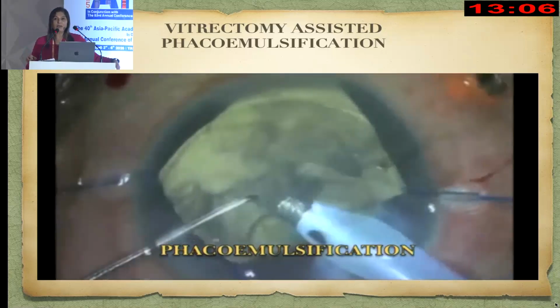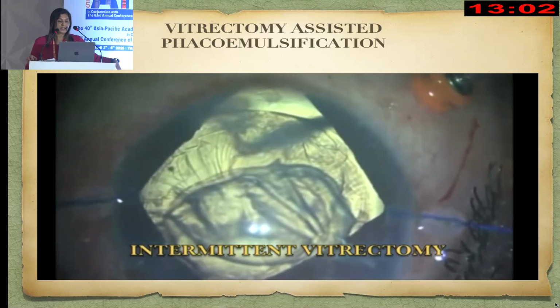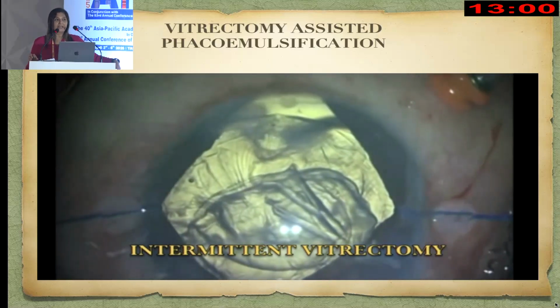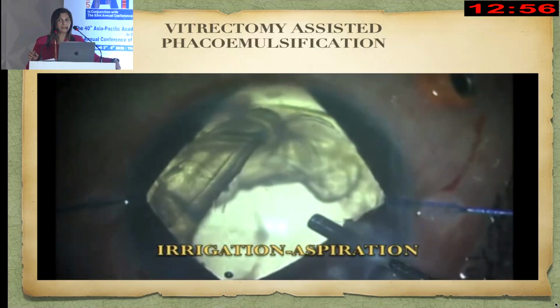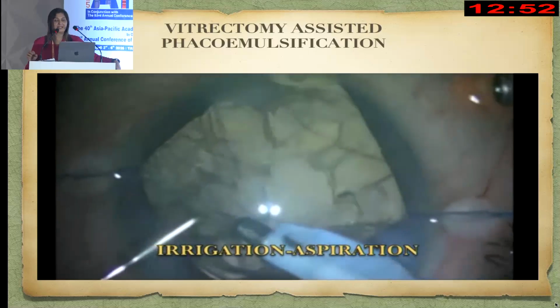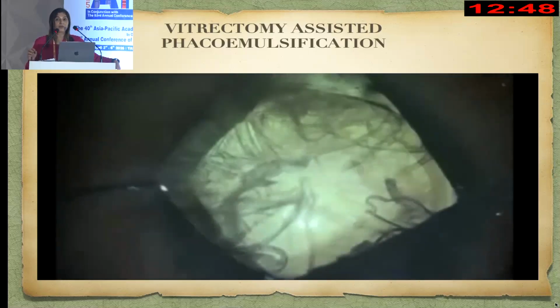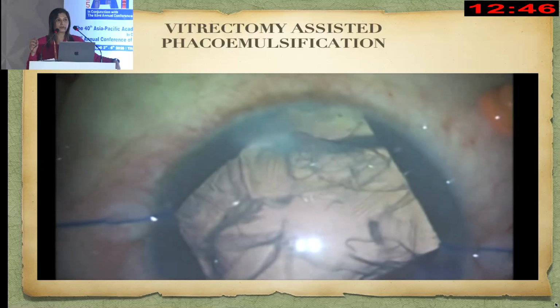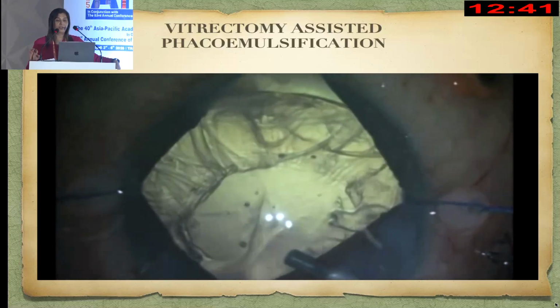So this is one method by which you can control the bulge of the vitreous that comes around. The only clinical tip here is that, when you put the vitrectomy probe, you should be seeing the tip of the vitrectomy probe. You should not cut the posterior capsule accidentally with the tip of the vitrectomy probe. That is a very important thing, where to put the trocar and the vitrectomy probe. You have to put it in the area of the dehiscence so that you keep on seeing it.